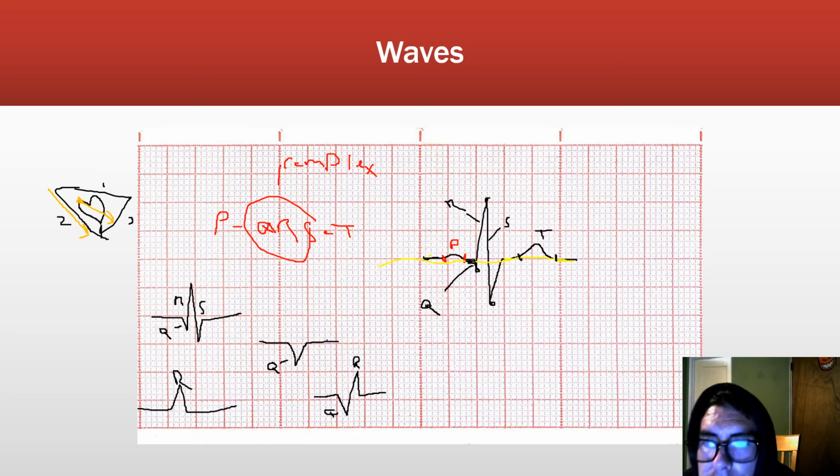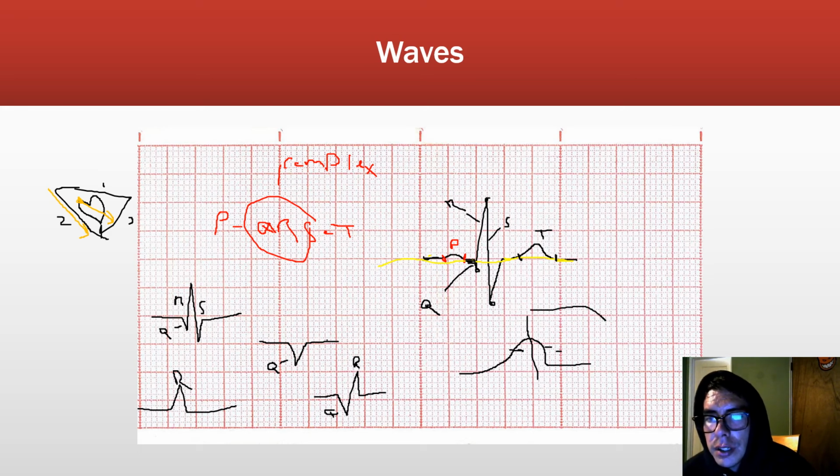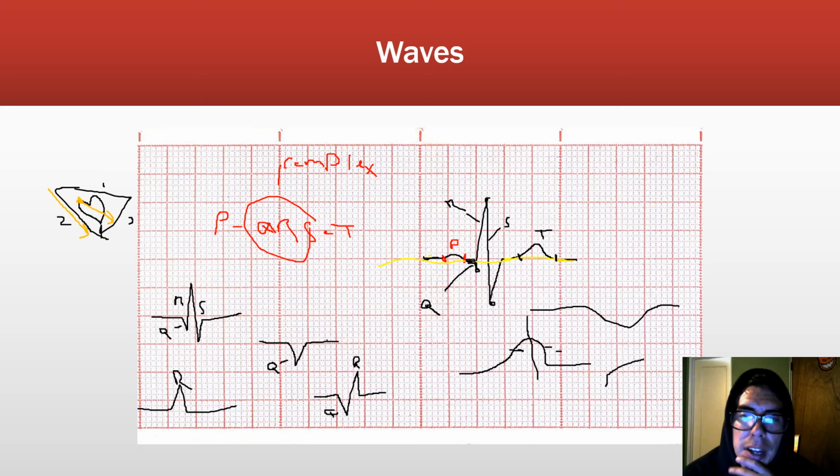And then for the T wave should be asymmetrical, so it should kind of do this. So if you draw a line from the center, it should be asymmetrical on these sides. And that again just represents repolarization. Inverted T waves like this are bad, or they can be bad. Flattened ones or slanting the wrong way, or like that weird concave shape, that can be bad, but that's not for this video, that'll be a different one.